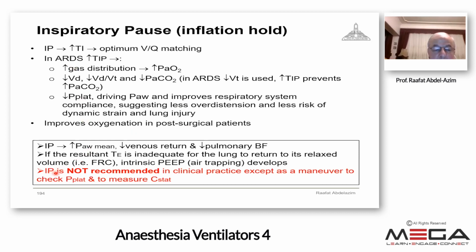Inspiratory pause, in clinical practice in healthy individuals, is not recommended except to check the plateau pressure and to measure the static compliance. In volume controlled ventilation, you can see the pause pressure, or sometimes it is not visible.